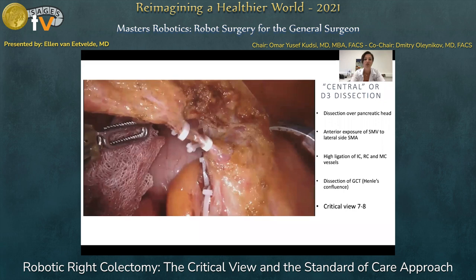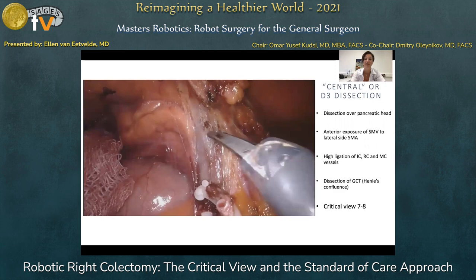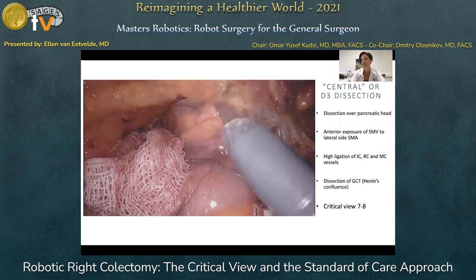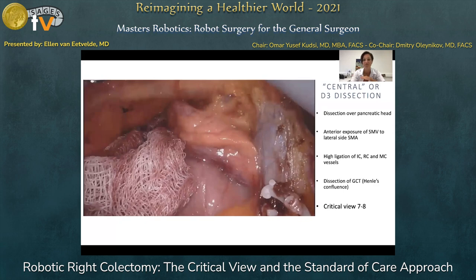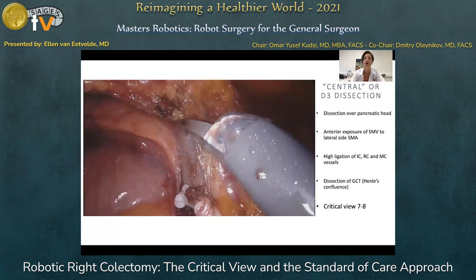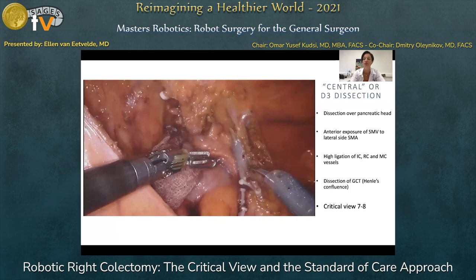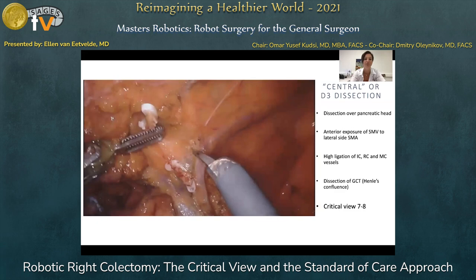The last part in teaching CME surgery is the central dissection. Here we see the transection of the right colic artery — a highly variable artery which is more often absent than present. After clipping of the ileocolic vessels done beforehand, we follow the motorway in a cephalic direction until we encounter the middle colic vessels. It is very important to clear away all lymph nodes and not to transect any structure before correct identification. For the middle colic vessels, you need to know which is the left branch and which is the right branch, and then you can selectively clip the right branch.